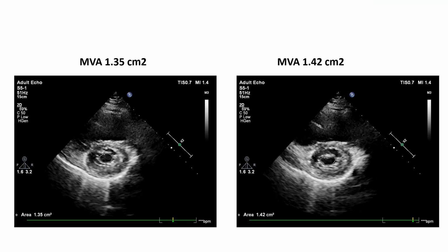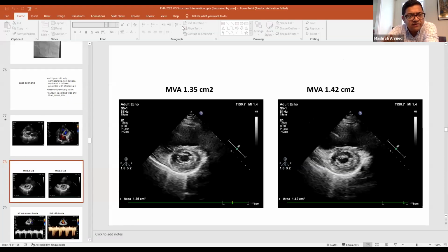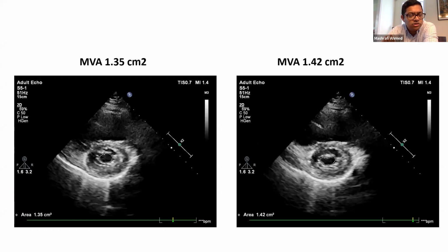There is also a Chinese company whose name I forgot. I think they also have a self-expanding TAVR valve, right? I don't know what the costing is for that, or whether it is really good in comparison to the Indian one. Was there any experience like that? No. The first one ever was done with a Medtronic valve in a private hospital, but in our institute, at NICVD, all the valves are made.